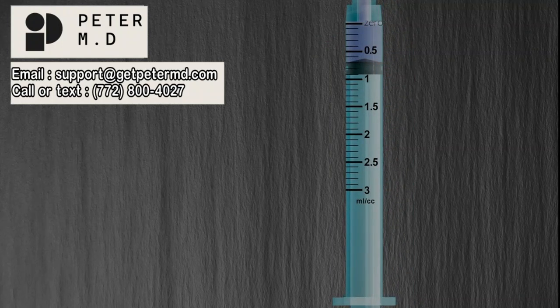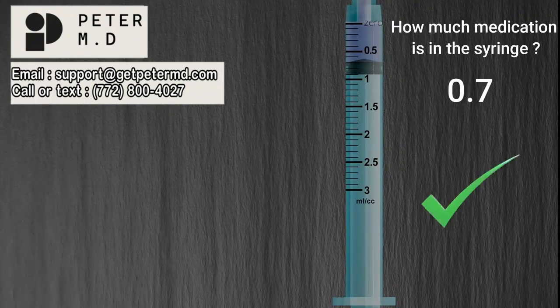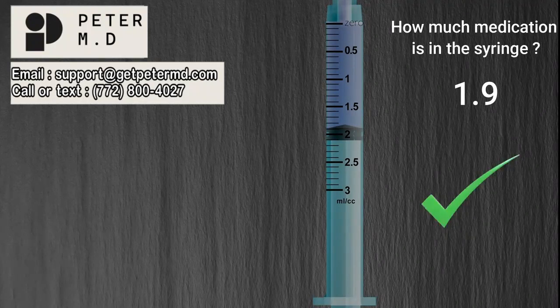Now that we know the value of all the graduation marks, let's determine the amount of medication in the syringe. How much medication is in this syringe? If you stated 0.7 ml, you are correct. Try one more — how much medication is in this syringe? If you stated 1.9 ml, you are correct. Great job.